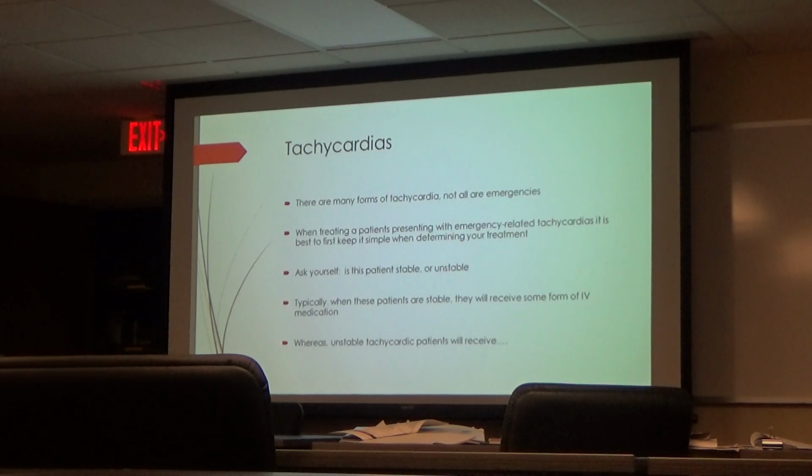All right. So we move on to the tachycardic rhythms. Again, why is a patient tachycardic? I think it's really important to note that with any type of rhythm that you have with your patient, we have to ask ourselves, why are they? Try and figure that out so that we can appropriately know how to treat them. They could be tachycardic for various reasons.